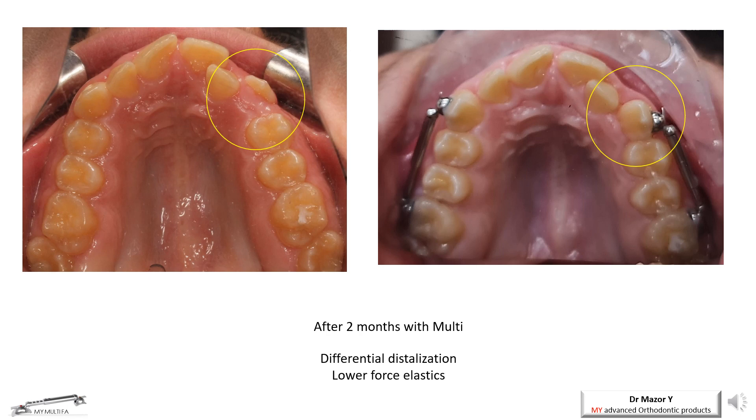Initially, in the left photo, the upper left canine is in a high position with a distance from the premolar. The differential activation — canine first movement — is achieved by using quarter-medium intermaxillary elastics without locking the telescope. On the right photo, an impressive result is demonstrated after two months of treatment, as the canine is extruded and moved into contact with the premolar. At this point, the telescope must be locked to allow segmental movement of a group of teeth.